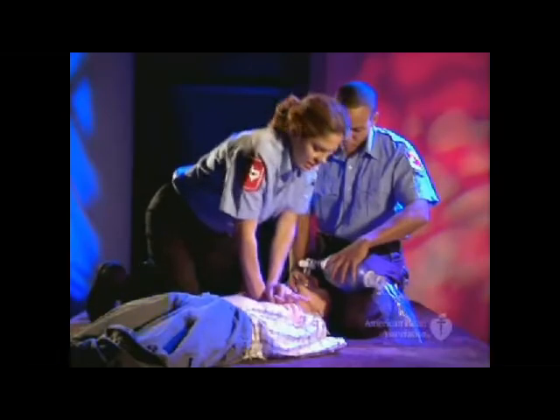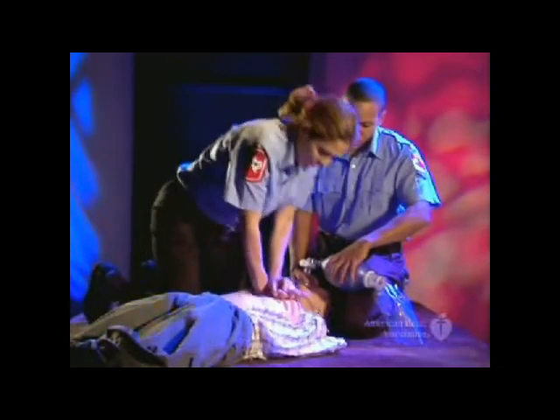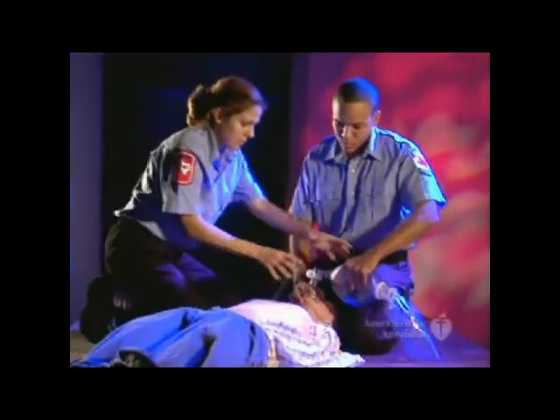Deliver each breath over 1 second, making sure you do not deliver the breath too quickly or forcefully. This will help reduce the chance of gastric inflation, air going into the victim's stomach instead of his or her lungs. If too much air enters the stomach, it can cause vomiting and potentially aspiration.